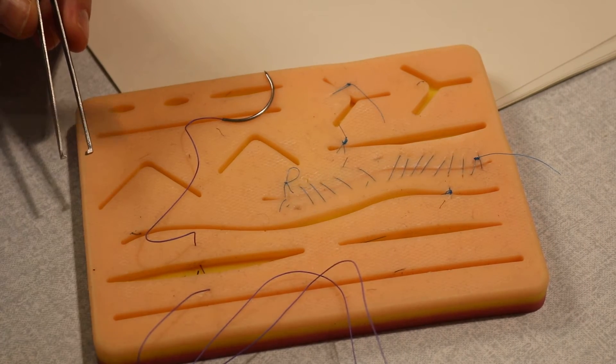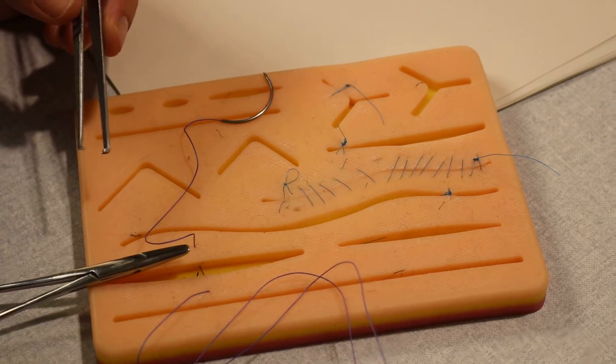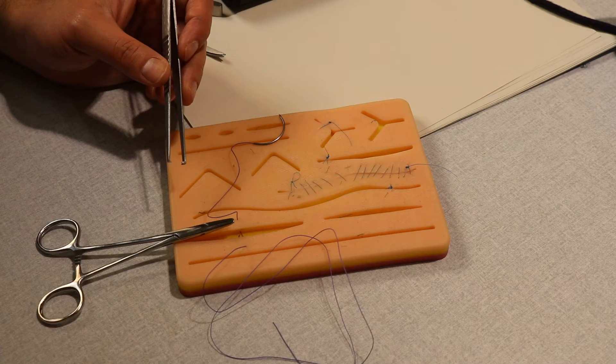You can use two ways: hand tying or instrument tying. I'll zoom out to show you better.